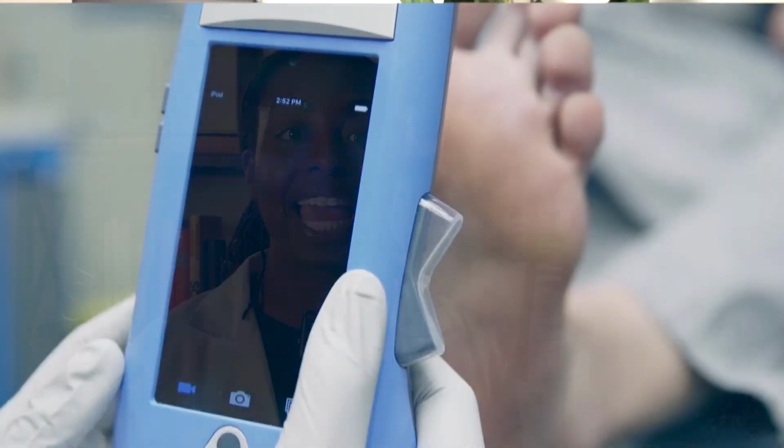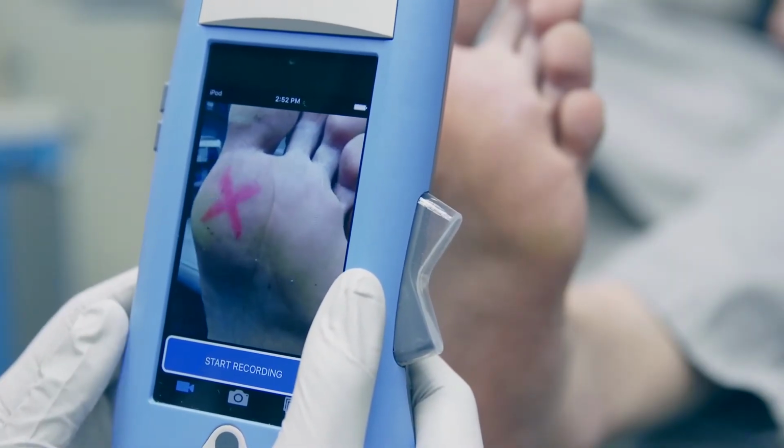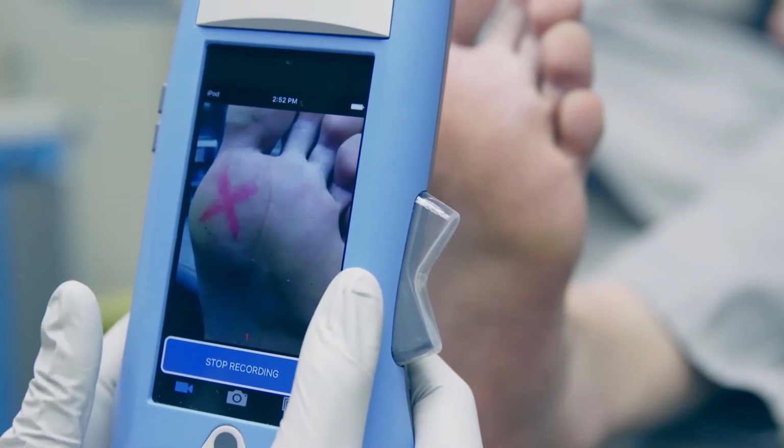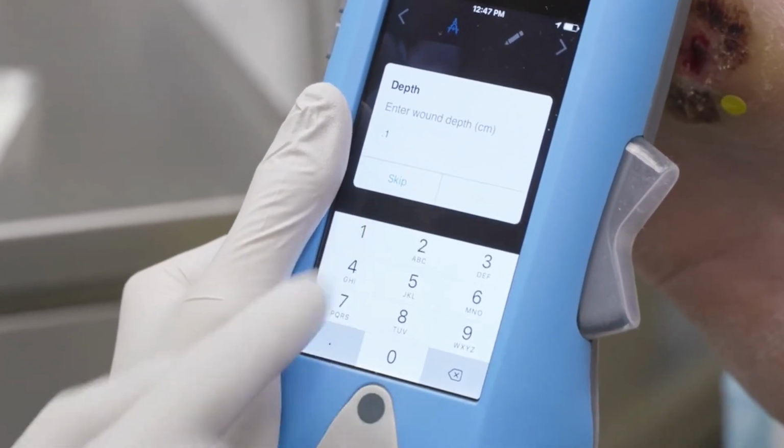Let's start with what we're actually talking about. AI wound assessment is software, usually on a tablet or a smartphone, that uses a camera and computer algorithms to analyze wounds. So you take a picture of the wound and the AI measures it, identifies tissue types, tracks changes over time, and flags potential problems like infection or stalled healing. Think of it as a second set of eyes that don't get tired, eyes that remember exactly what the wound looked like 2 weeks ago down to the millimeter.